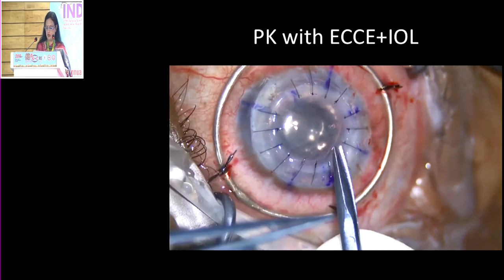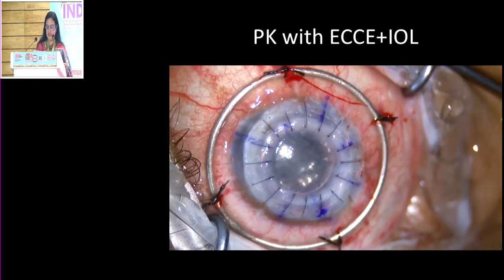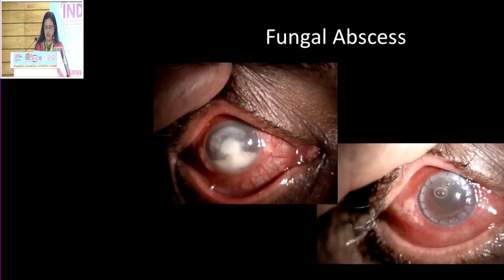I leave behind a small air bubble so that I know the anterior chamber is well formed, particularly in these cases. These are some of the cases that we can do. Thank you.